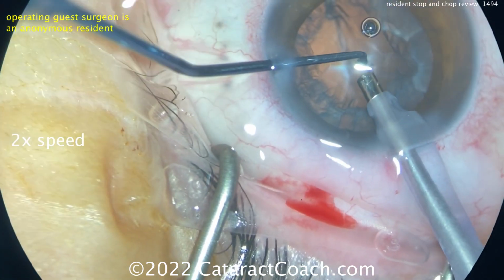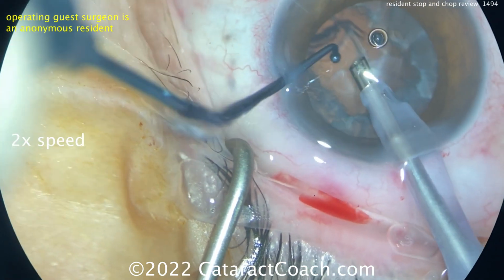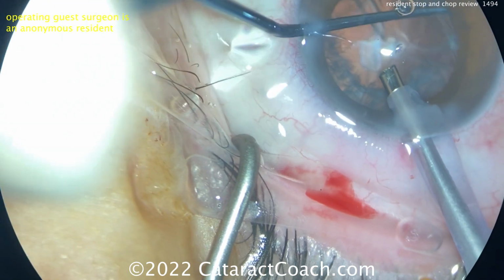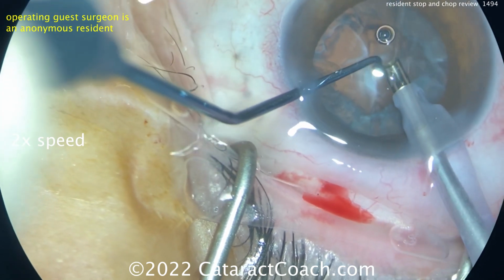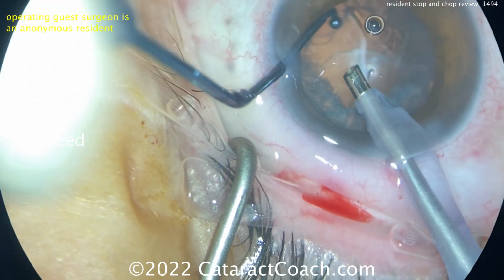You definitely have to learn stop and chop. And if you're a young resident, this for case 128 is very good. You can tell it's a resident though, because look, where's the eye? Not in the center of the operating field. See how the eye drifted up there to the top right corner of the screen? It just makes you want to not watch the rest of the video, huh? I agree with you. Me too.